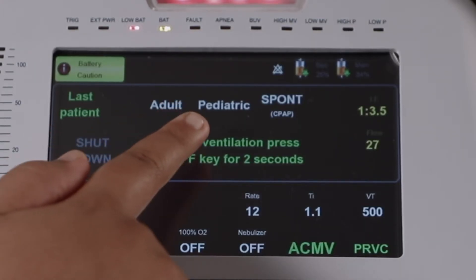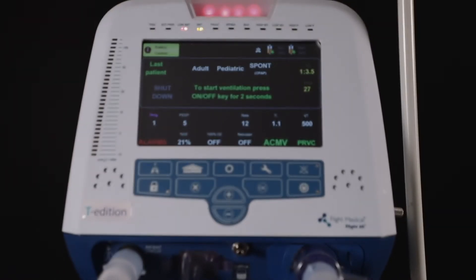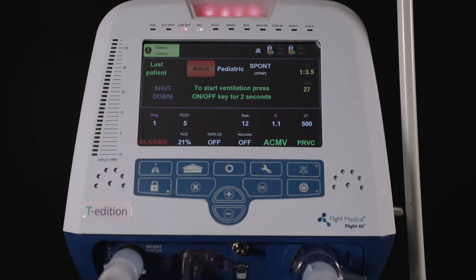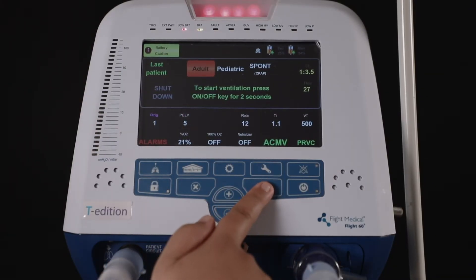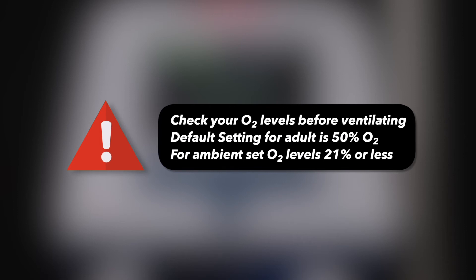Choose the type of patient — adult, pediatric, or SPONT. To select adult, press adult and press OK. A new alarm appears on the top left which says 'Check O2 Supply,' as the default setting of the ventilator for adult is 50% oxygen. Make sure to change the oxygen percentage to the patient's requirement.